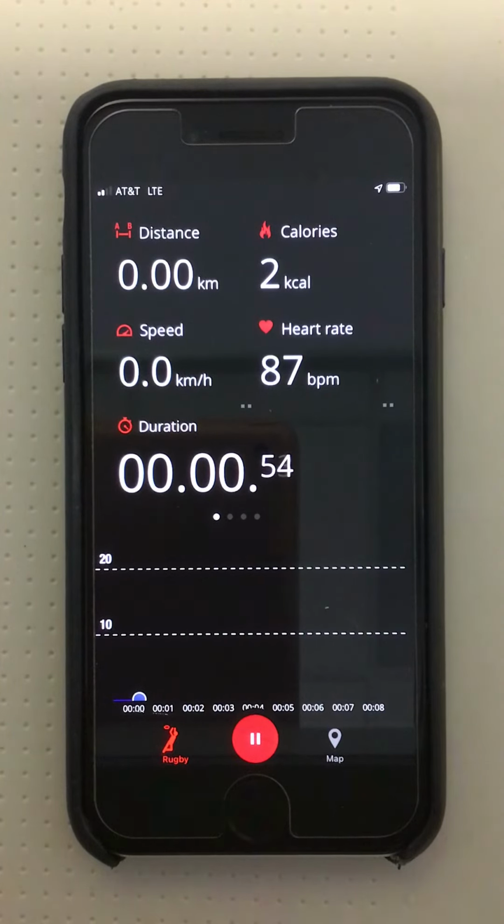When the text changes to green, I know that we have now entered the targeted high intensity training zone. At 80% heart rate max, the heart rate text color will transition to yellow. We are right at the top of the high intensity training zone when the text is yellow.